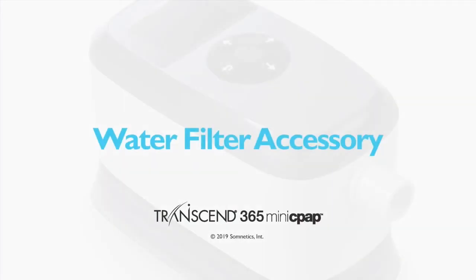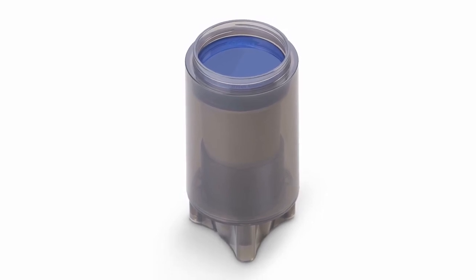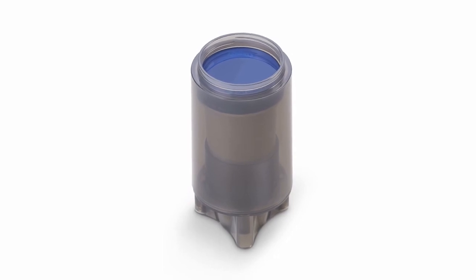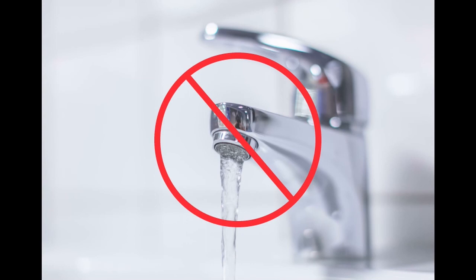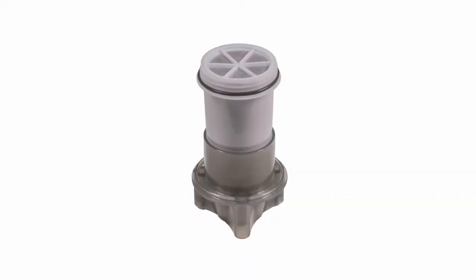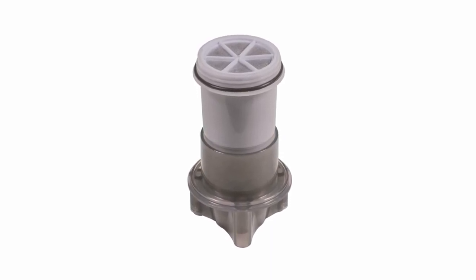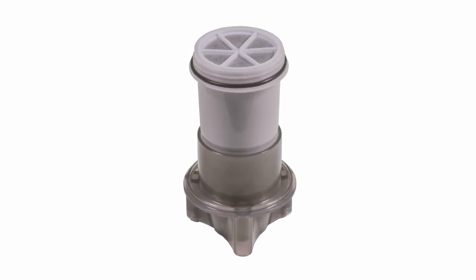Using the 365 mini CPAP accessory filter and filling the humidification tray. The Transcend 365 mini CPAP requires the use of distilled water or water filtered with the approved Transcend 365 portable water filter. Use of regular tap water will damage the humidifier and void the warranty. Using the Transcend 365 portable water filter is simple. Here's how it works.